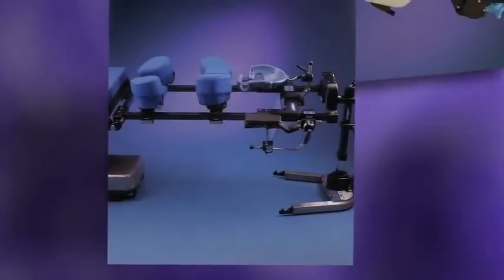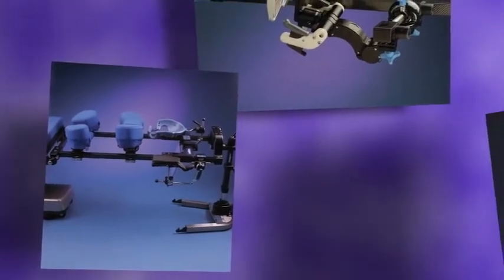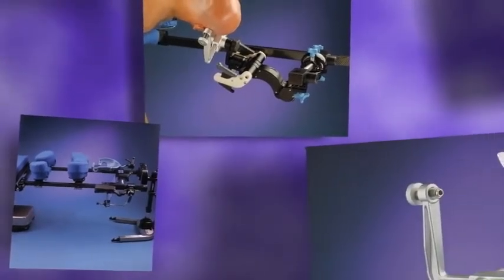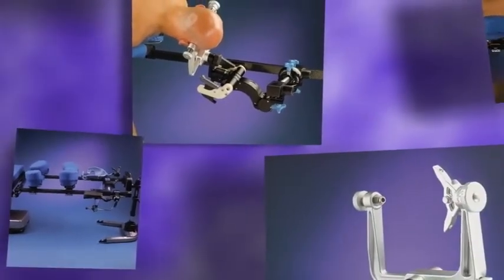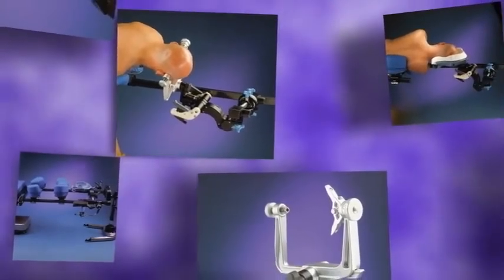The following video will introduce the products in the Allen Spinal Suite. The setup and adjustment of each product will be demonstrated, along with suggested techniques for transferring and positioning a patient. The FlexFrame is an OR table extension. It serves as the platform for the rest of the product suite. All products used on the FlexFrame are compatible with the Jackson table.